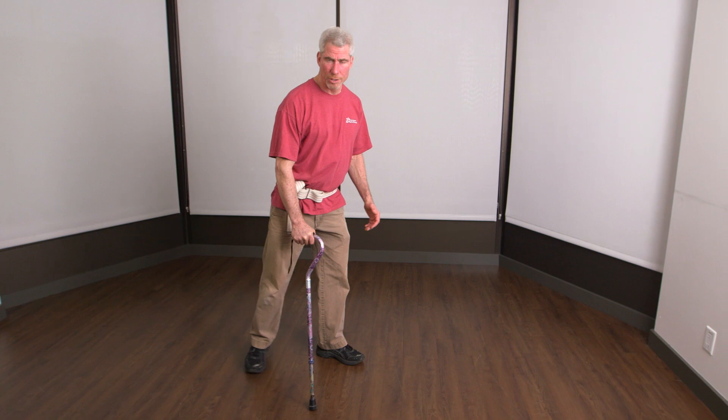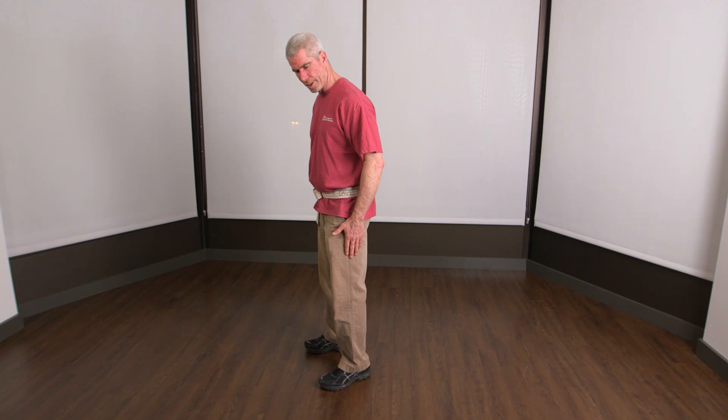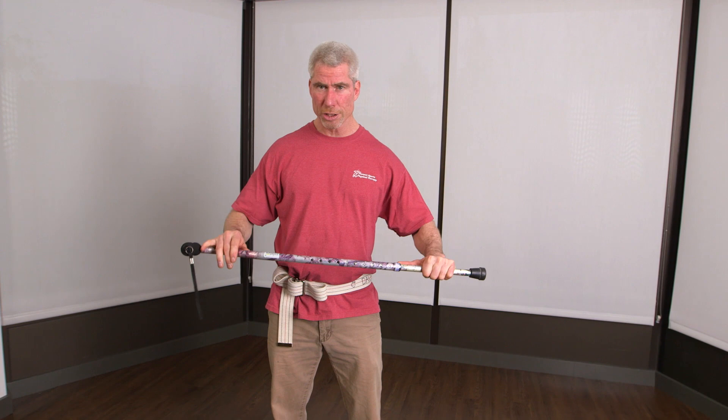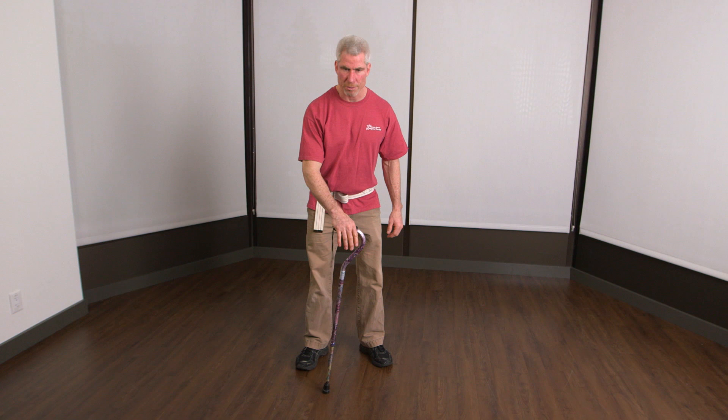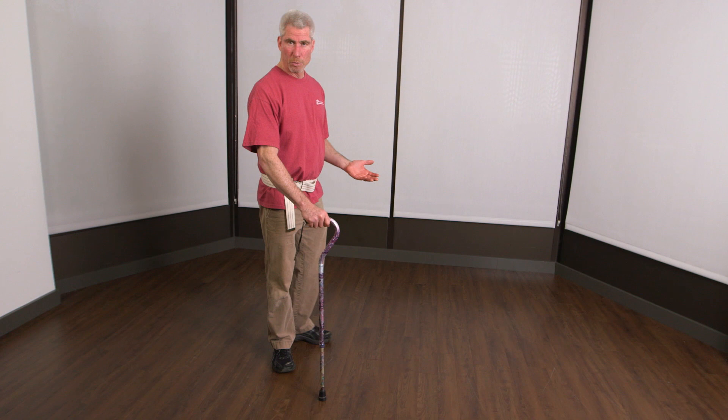What if we were to use that cane for balance instead of for support for an injured leg? We might want to make a tripod out of it, because the standard position isn't a very good tripod. We want it out in front. It may need to be one, maybe two inches longer, so that when I put it in front of me, my hand just goes down to it and I don't have to bend over. When I'm walking with it, I want it on the ground giving me feedback, telling me where I am in space.